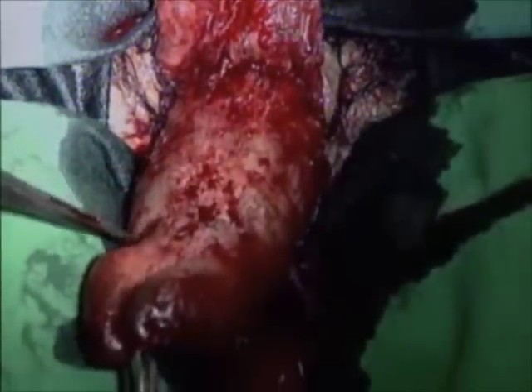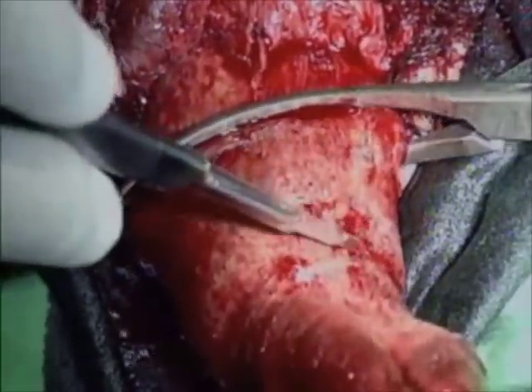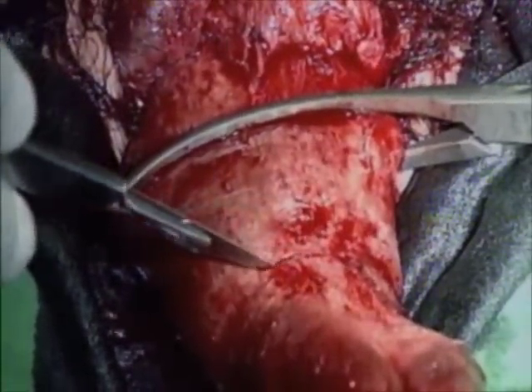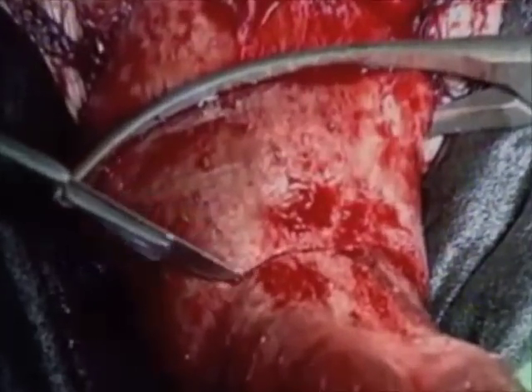The technique enables an outstanding visualization of penile deformities and their ideal correction. Hourglass phenomenon and a marked dorsal curvature were indicators for the grafting technique. At the plaque region, two parallel relaxing incisions are performed. To avoid bleeding, a vascular clamp is placed at the base of the corporal bodies.